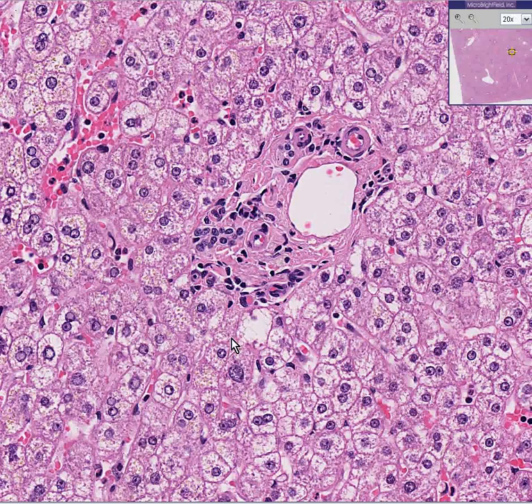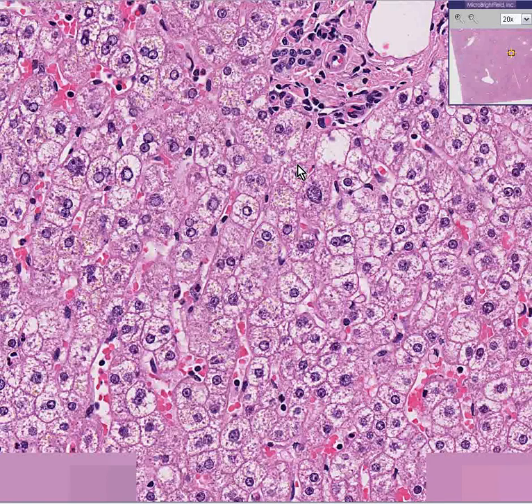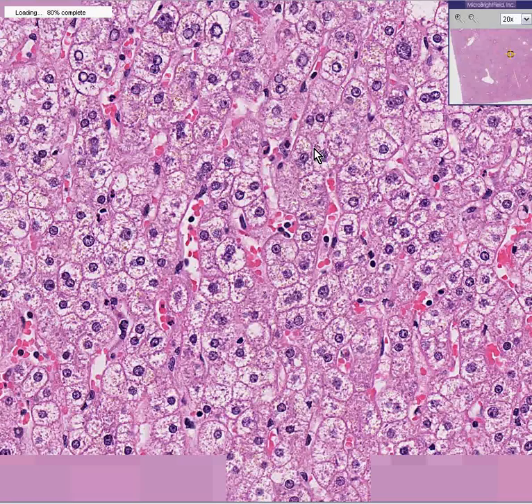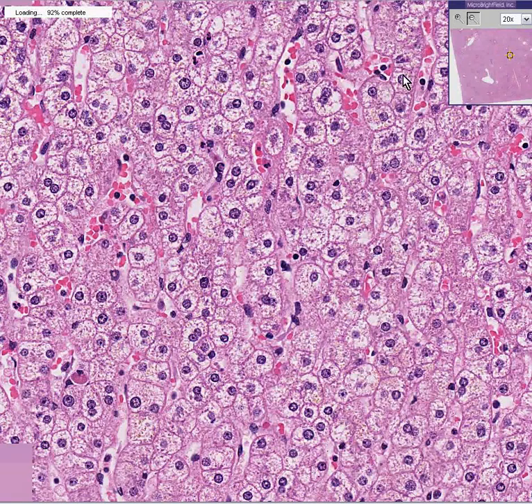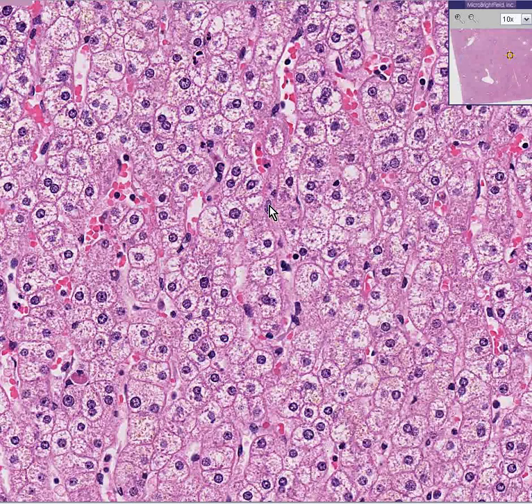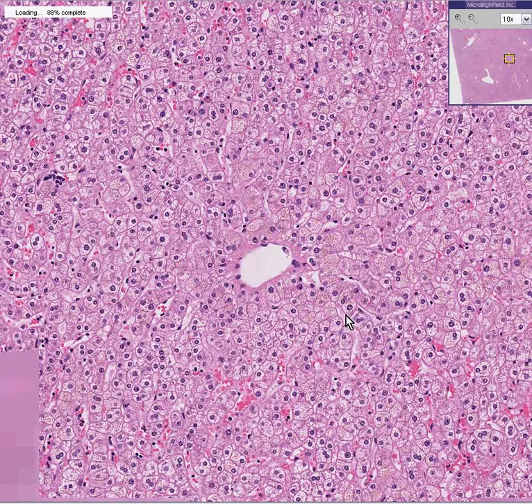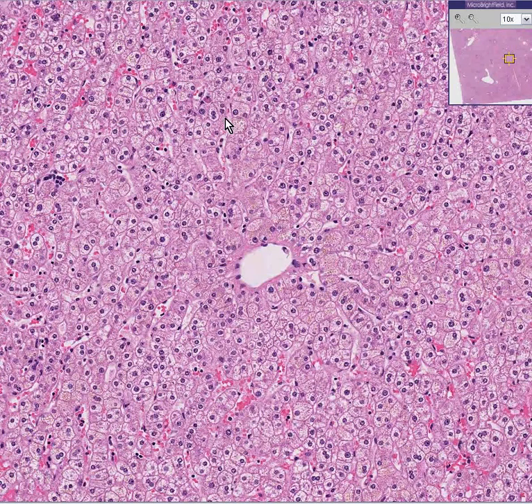And it's not inflamed. It's well delineated from the surrounding cords of hepatocytes. And it doesn't look anything like a central vein, because in a central vein you only have the vein and no connective tissue around it. And if you could imagine that these hepatic cords and the sinusoids in between them are kind of converging towards these central veins, originating ultimately from all the surrounding portal areas.